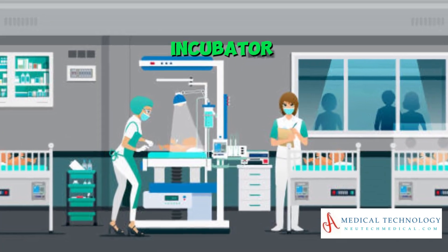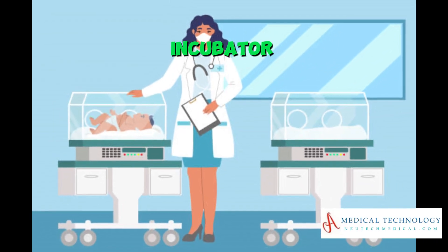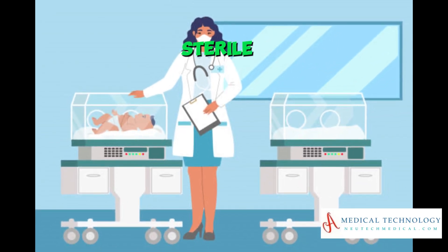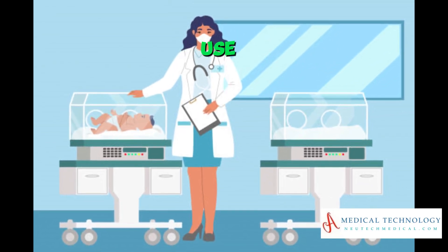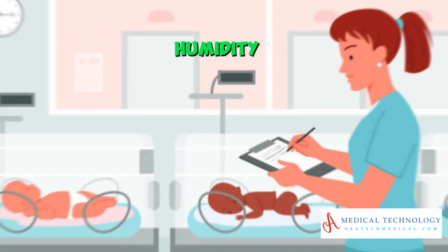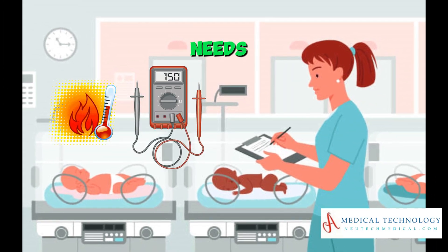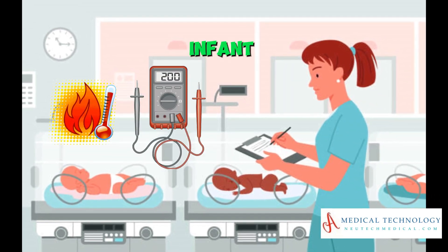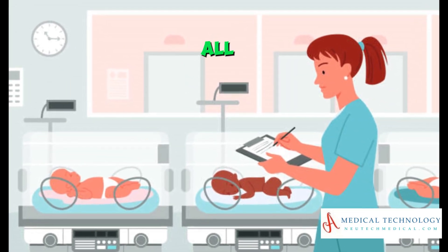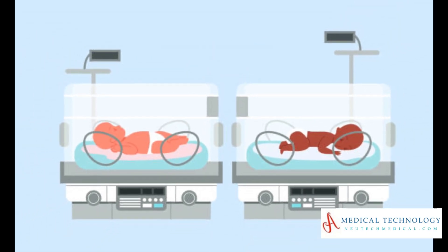Preparing the incubator: Ensure that the incubator is clean and sterile before use. Set the temperature and humidity levels according to the specific needs of the infant. Check that all monitoring equipment and lamps are functional.